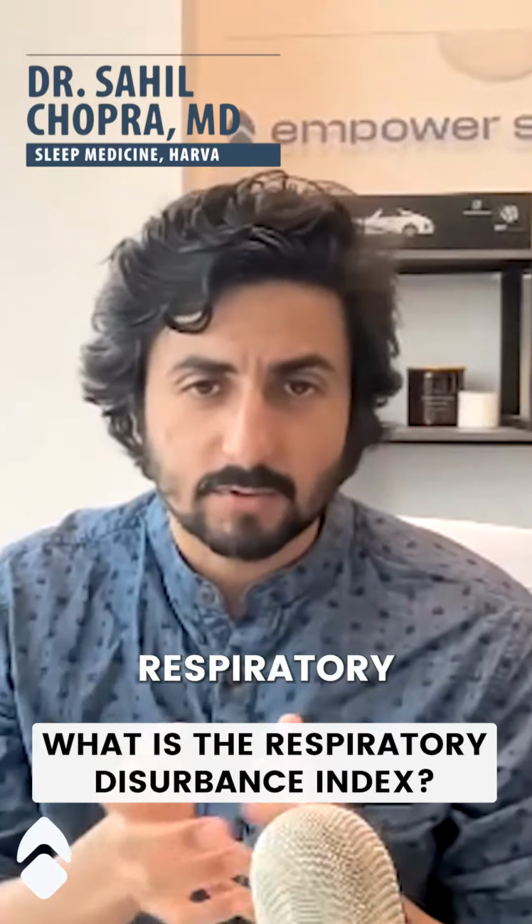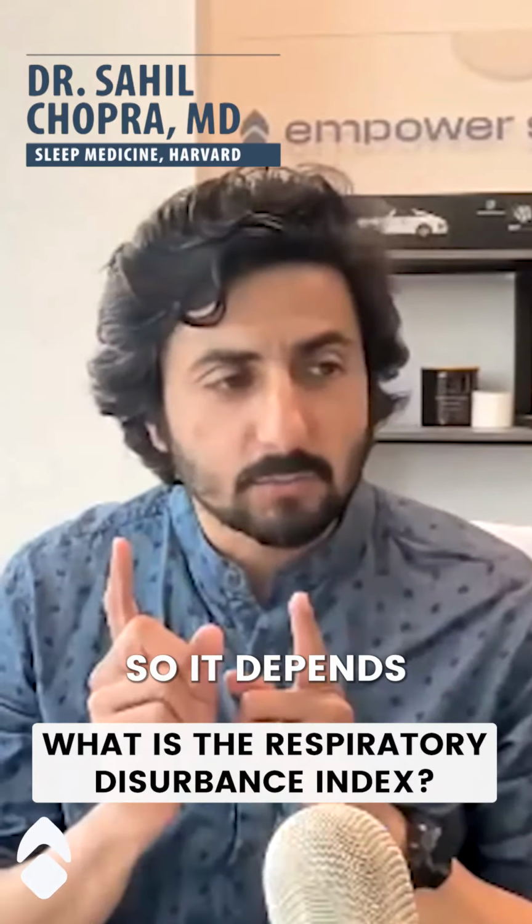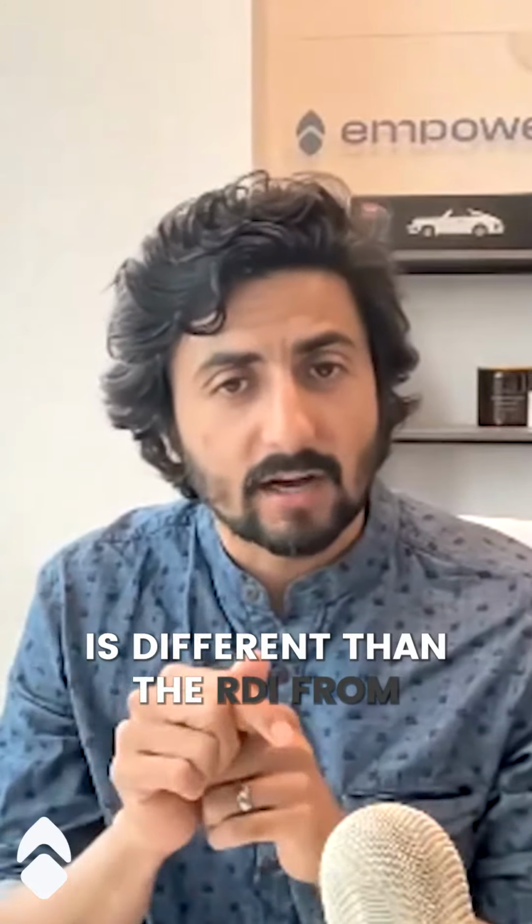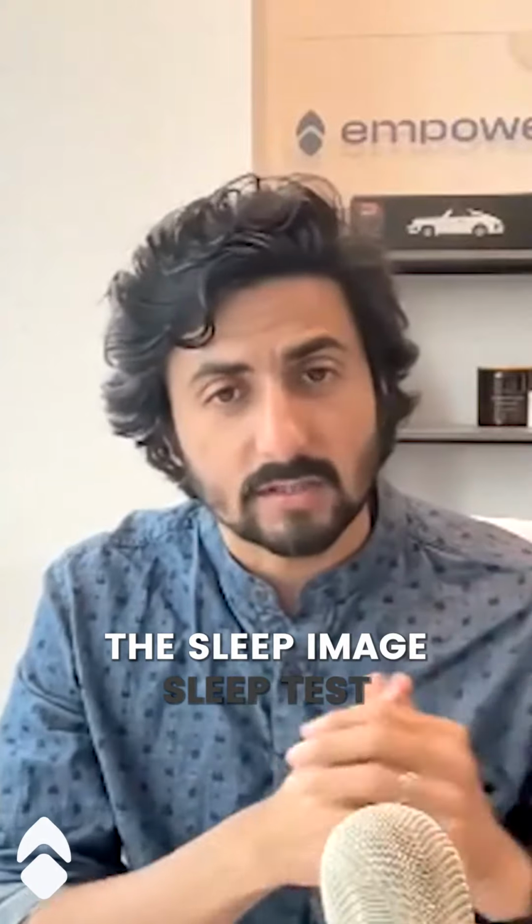RDI is the Respiratory Disturbance Index. So it depends what test one is using to estimate RDI. The RDI from an in-lab sleep test is different than the RDI from, for example, a Sleep Image sleep test.